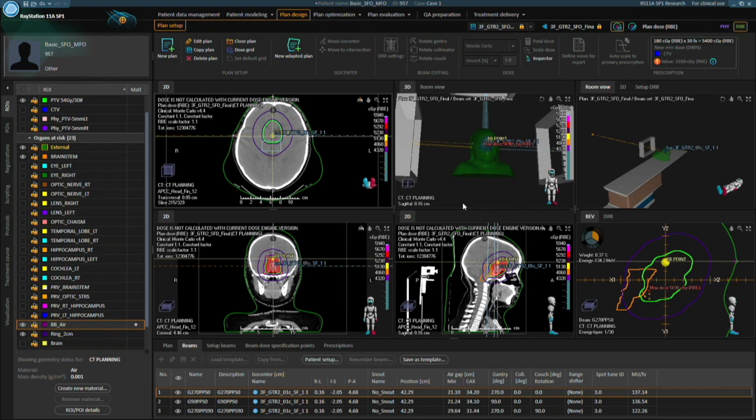I think the question is, when do you choose to do MVCT? All kinds of materials, or any specific material? All kinds of materials. And you literally contour that? Yes, we will do it.